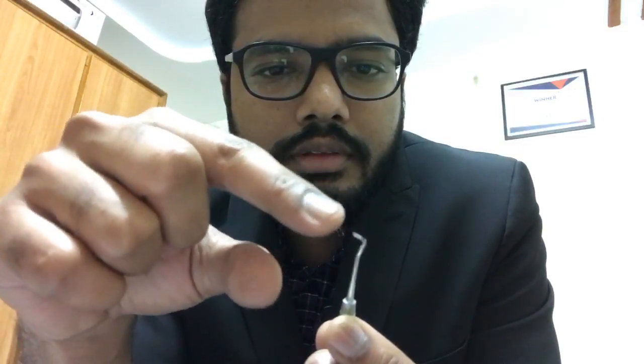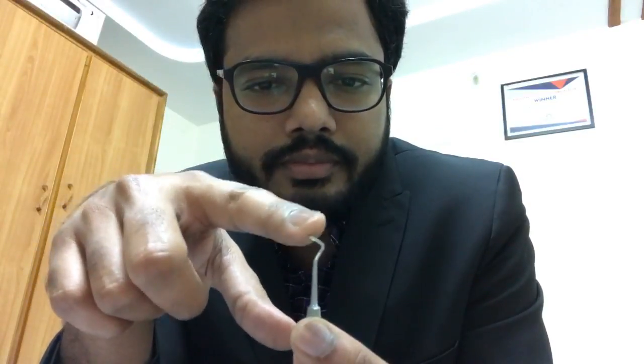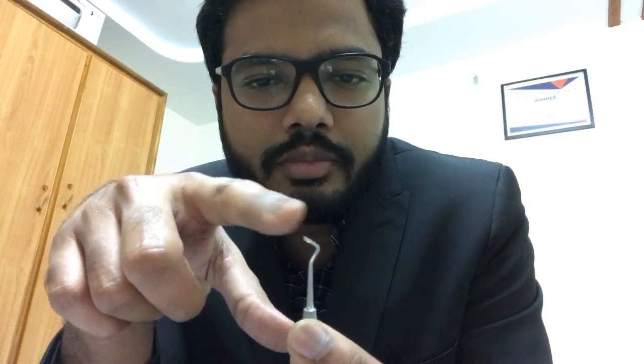Then coming to whether it's mesial or distal, observe the cutting portion, the edge of the blade. You'll have a sharp, pointed projection facing away from the long axis of the instrument, away from the long axis of the instrument. That is distal.